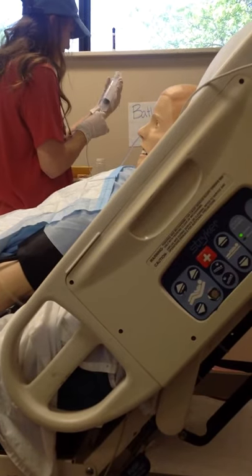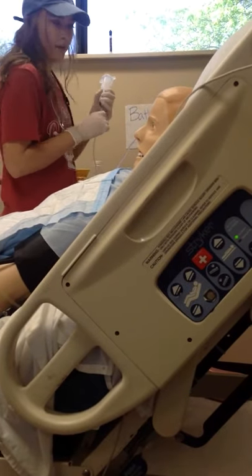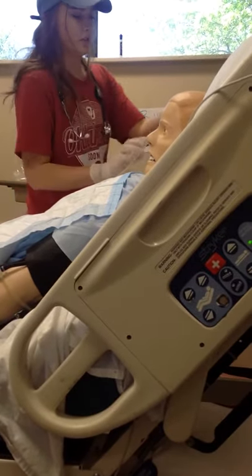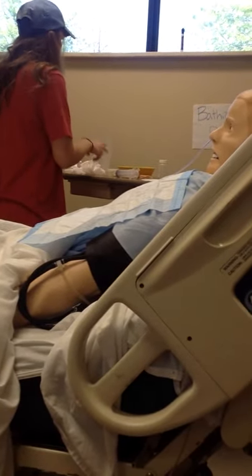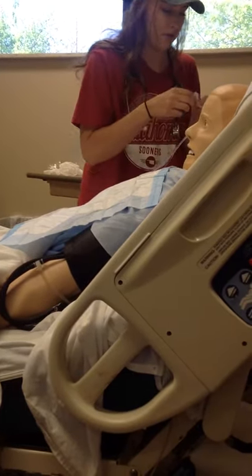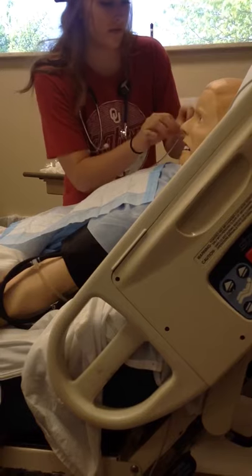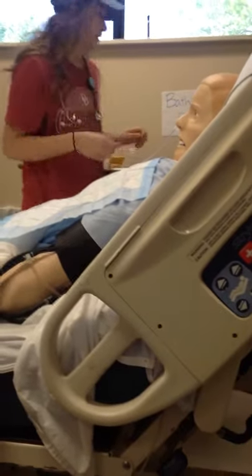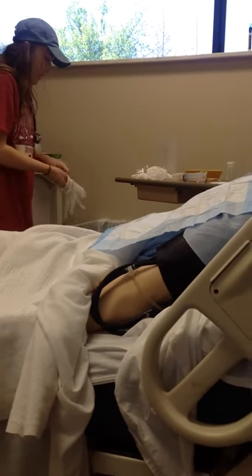All right, now we're going to take off the syringe and clamp the tube back up, and attach it to your gown. I'm going to remove my gloves and perform hand hygiene. I'm just going to tape it up and mark where the tube is inserted, so it doesn't come out. Does that feel okay? Yeah, it's okay. I'm just going to perform some nasal care really quick so your nose doesn't get chapped or dry.